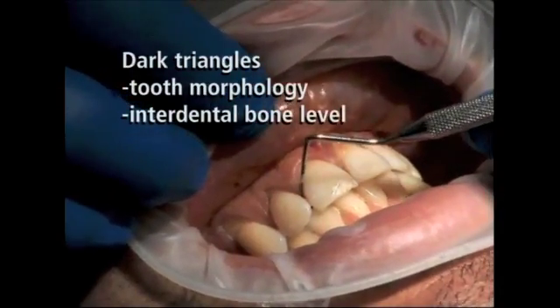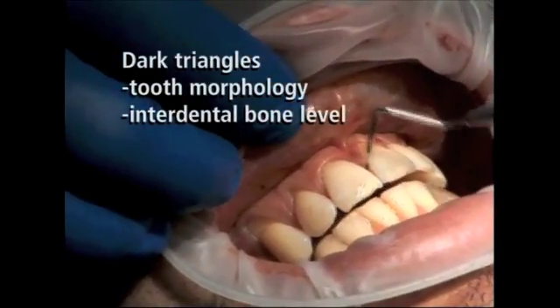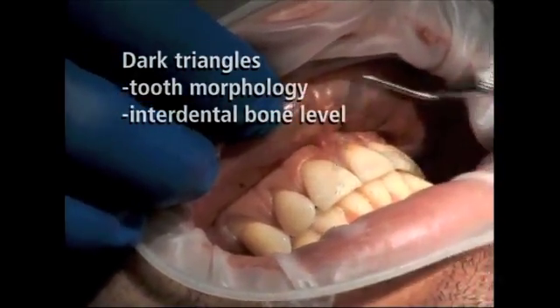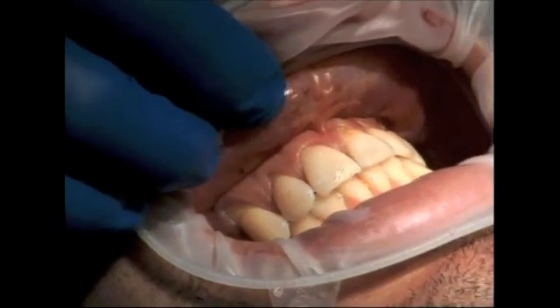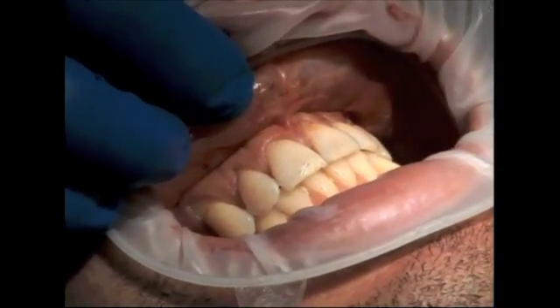Before considering any periodontoplastic surgery procedures, such as a periodontal graft, it is recommended that a patient's inflammation is under control. Please check for pockets and treat accordingly before attempting any type of oral plastic surgery procedure.